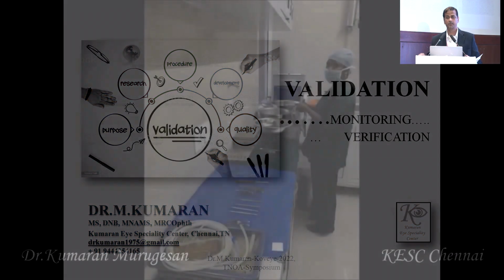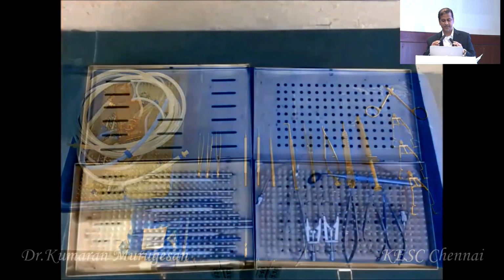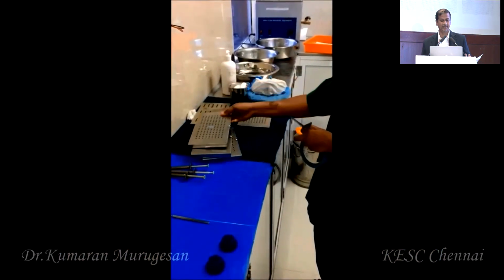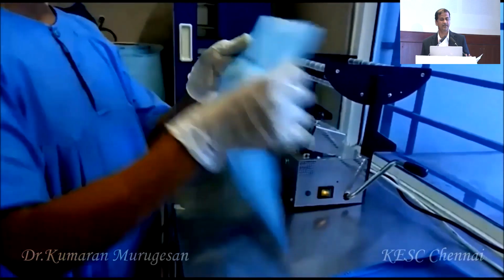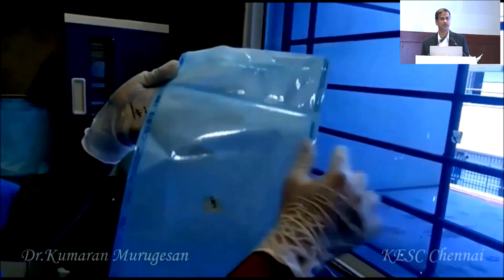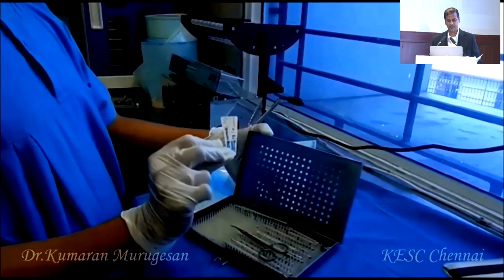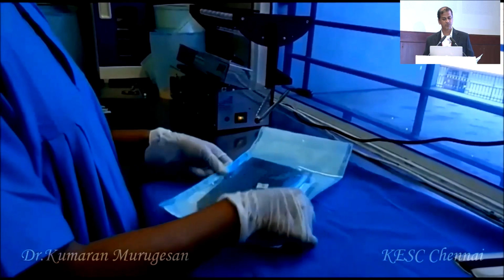Okay, now we come to the most important part. So this video tells you how all the validation has been done. Once all the instruments are cleaned, they have to be packed individually in each set. And you can see how the staff is putting the class 1 indicator over every tray. So this is the class 5 indicator which goes inside every tray. You can see how loosely the instruments are packed.